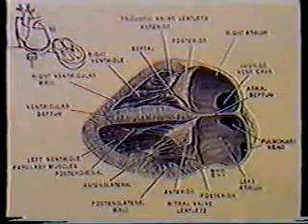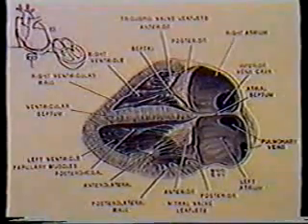The transducer in the subcostal position can be tilted such that the ultrasonic beam passes upward into the thorax, or into the abdomen. This provides unique information about cardiac structure and also allows imaging of the inferior vena cava, hepatic veins, and abdominal aorta. This is the subcostal four-chamber view.